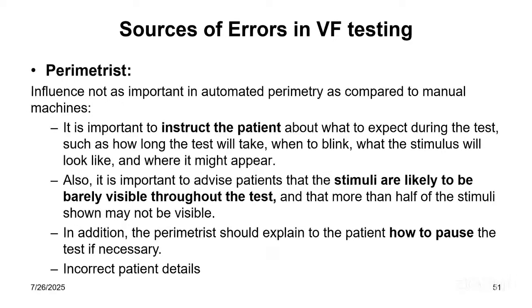And then from the perimetry side, though this is not so important for automated perimetry, it's good that you instruct the patient so that the patient understands this test before you start it. And then also encourage the patient that it's not all stimuli that they will be able to perceive.